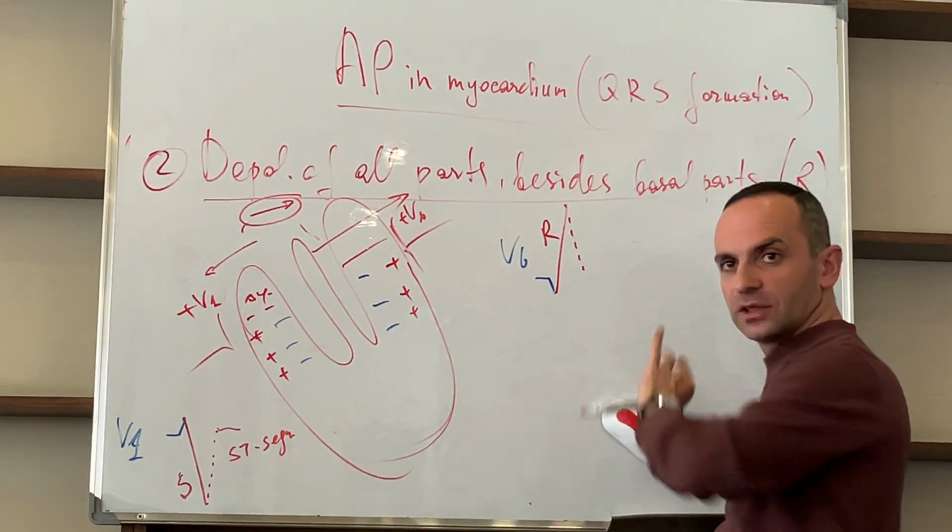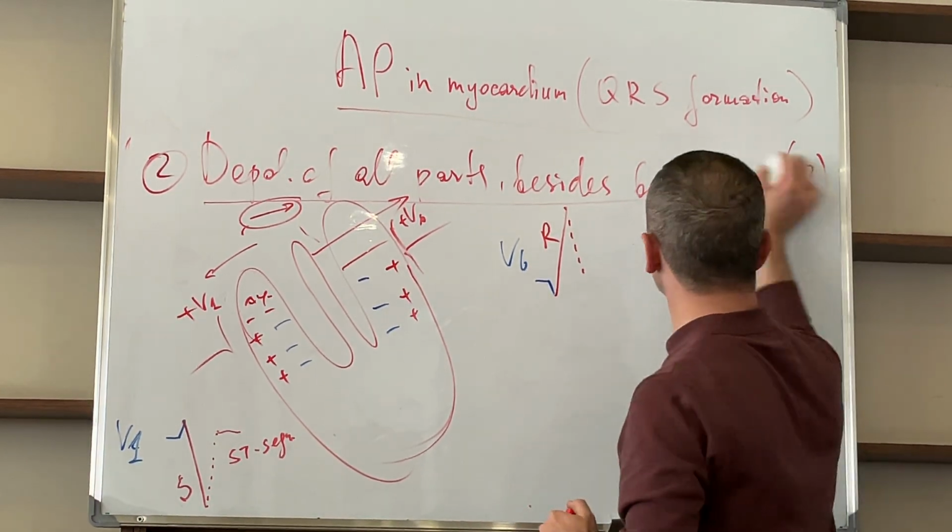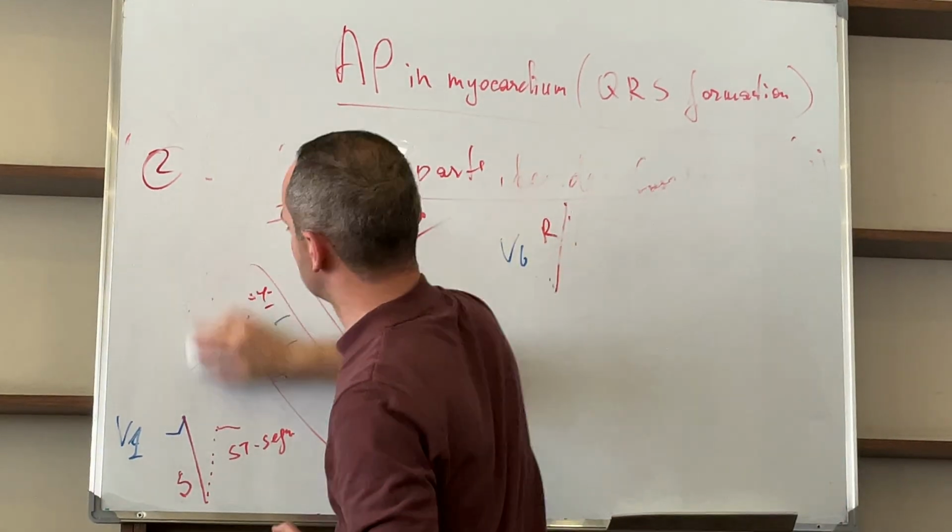So, this is over. Third moment: the depolarization of basal parts.